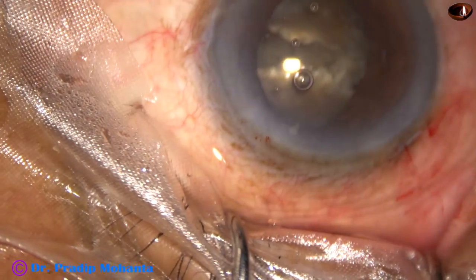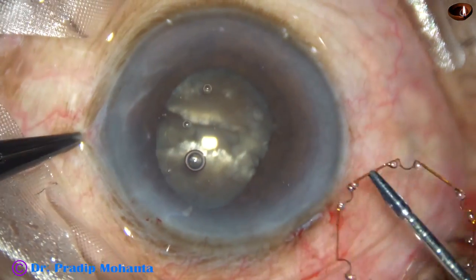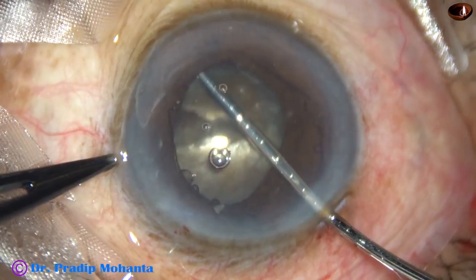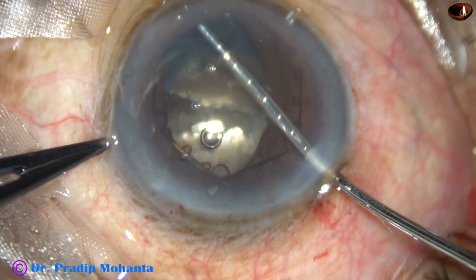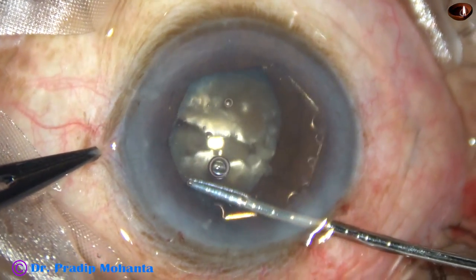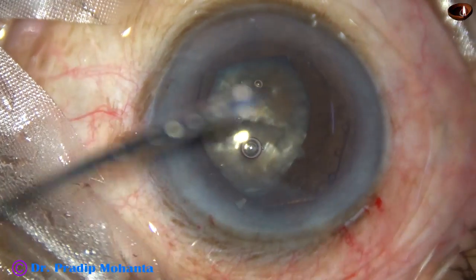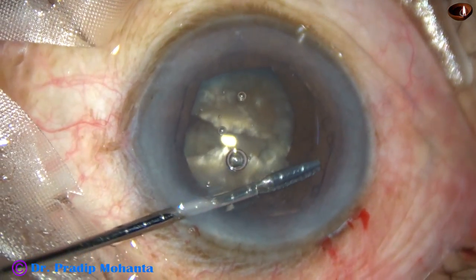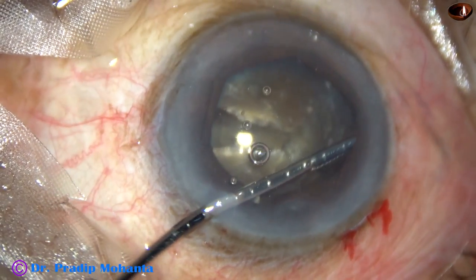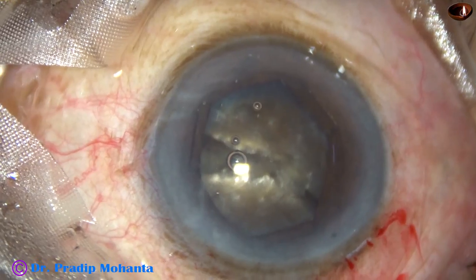This is the pupil expansion device I use nowadays: the B-hex pupil expander, invented by Dr. Subhan Bhattacharji of India. B-hex means Bhattacharji hexagonal. It is made of polyimide, a plastic material. There is no joining — it is a single-piece, single-plane ring with notches and flanges, where alternate flanges are tucked.